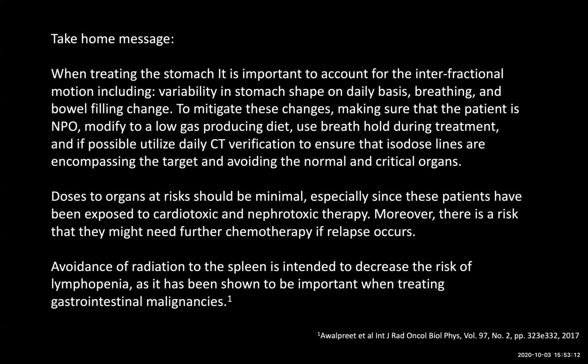Doses to organs at risk should be minimum, especially since these patients have been exposed to cardiotoxic and nephrotoxic therapy. Moreover, there is a risk that they might need further chemotherapy if relapse occurs. So therefore, avoidance of radiation to the spleen is intended to decrease the risk of lymphopenia, as it has been shown to be important when treating GI malignancies.